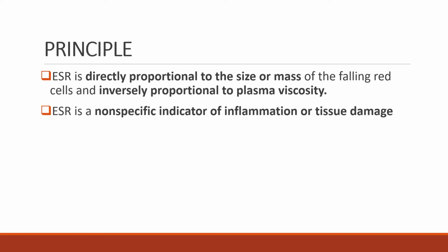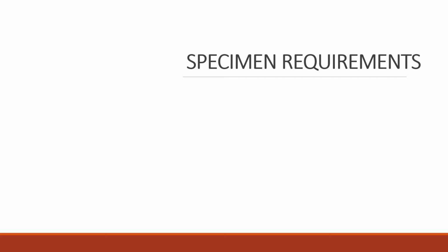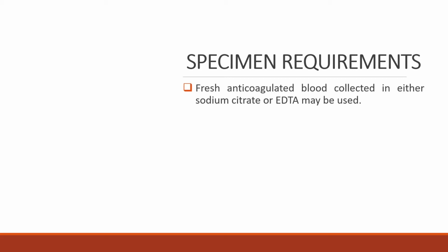The erythrocyte sedimentation rate is commonly used as a general screening test, and although this procedure is nonspecific, it is one of the most commonly performed and ordered laboratory tests. In performing this test, the following specimen requirements must be observed. First, the sample must be collected in a tube containing sodium citrate or EDTA.